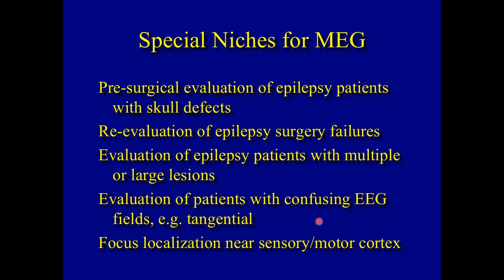It's also good where localization accuracy is important for people who have multiple lesions or a large lesion. Let's say there's a large resection site or a large area of encephalomalacia. Where around that area might the spike or seizure focus be? It makes it very good to localize which aspect of the lesion is most likely epileptogenic and where the surgeon would need to take more tissue.